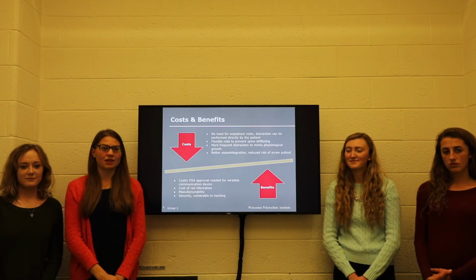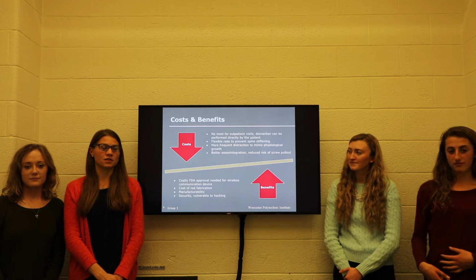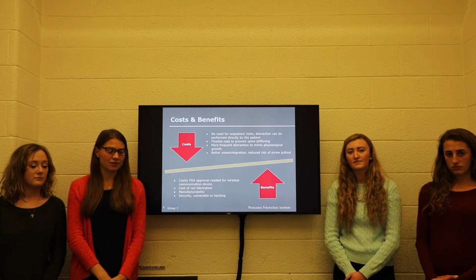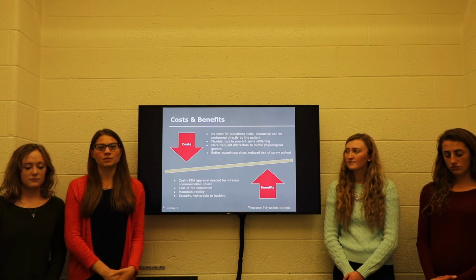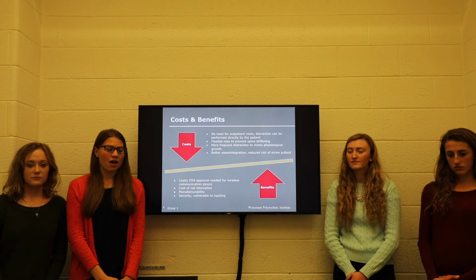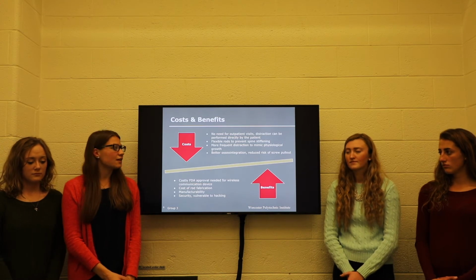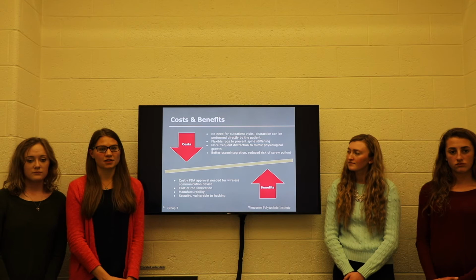The major benefit of our device is eliminating the need for outpatient visits, and also patients will not have to come in for revision surgeries to lengthen the rod, as the rod will be able to be controlled outside of the body. You can also program the distraction rate to each patient so it better mimics the growth rate. We're also using flexible rods, which will prevent the spine stiffening seen in other common implants. Additionally, by having the surface of the titanium modified, that will allow for better osseointegration.